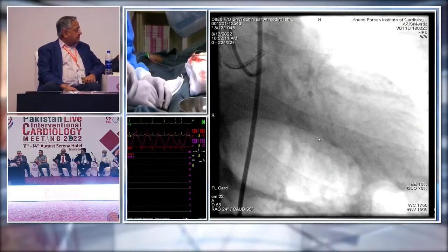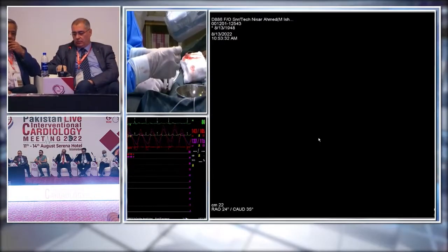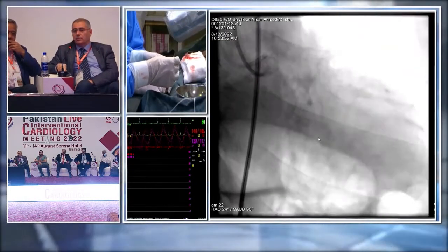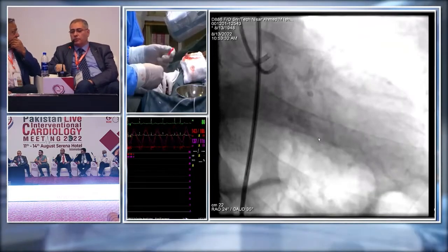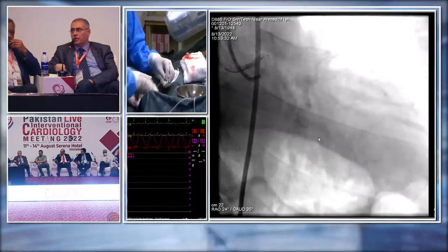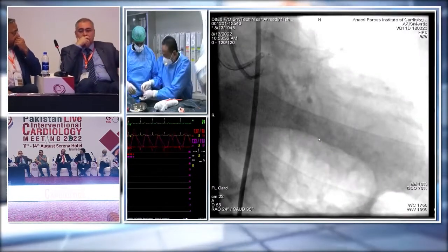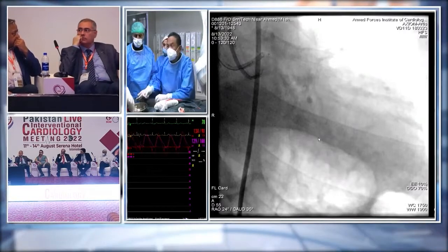Yeah, unfortunately, I have not used Mongo wires on our side, but I hear it's very good for subintimal tracking and so on. I would prefer Pilot 200 or Gaia Third for the first line. Okay, please. I prefer Progress or Conquest.